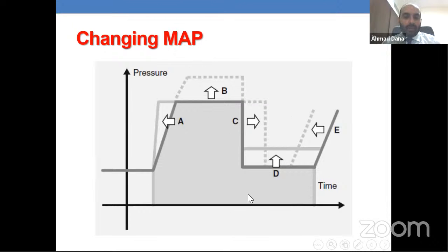Increasing the MAP in this diagram means that you can increase the oxygenation. It helps in recruiting the lung. Okay, so 5 steps or 5 ways. The main thing which we know is increasing the PEEP, but it can be done also by increasing the PIP, increasing the I time, decreasing the E time, or making the rise time more sharp.